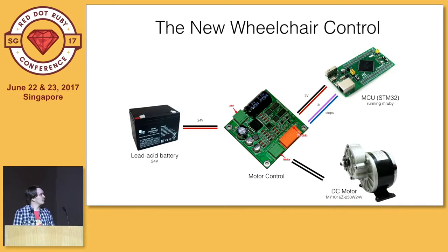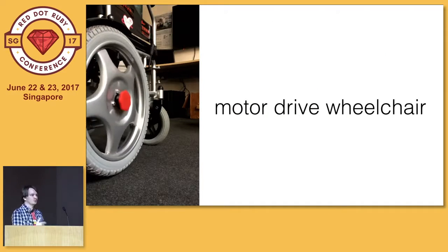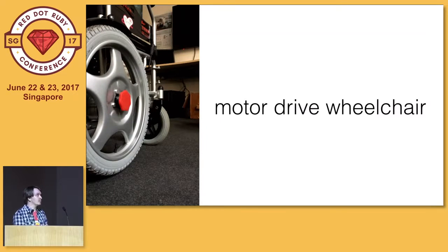The stepping algorithm is very similar to what I had already implemented on the stepper, and it actually happened that it was very easy to get started. In the end, you will notice that this was actually the easiest part of all to make it run. So obviously, this is now only done via IRB. Obviously, I do not want to control the wheelchair via IRB.